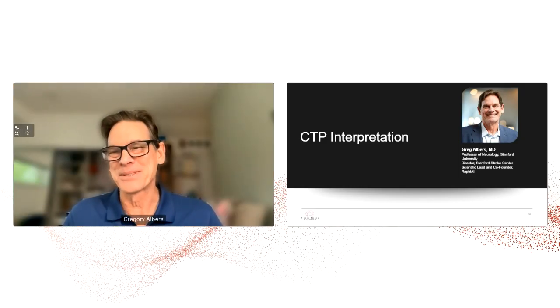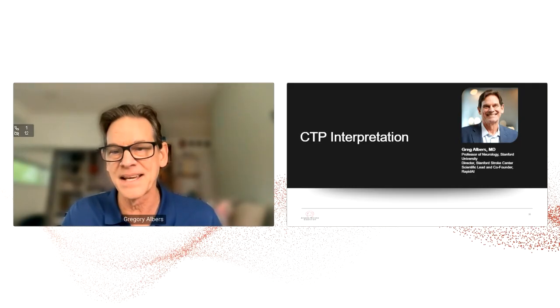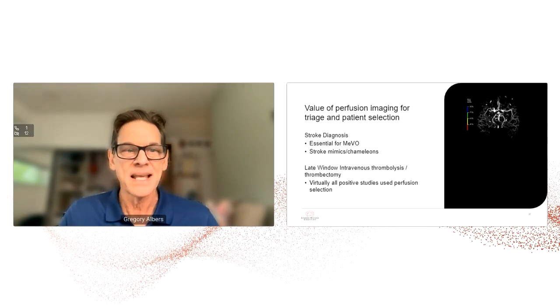Very happy to be able to participate in this meeting. My topic is interpretation of CT perfusion, which you already heard was very valuable for helping to decide which patients should be transferred into Anchorage. And I suspect this is something that you were not taught in your medical education. So I'll take the advantage over the next 25 minutes or so to provide some insights into how to interpret CT perfusion and what the value of CT perfusion is.